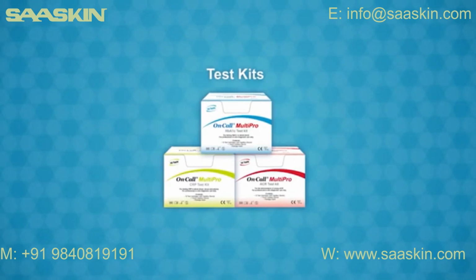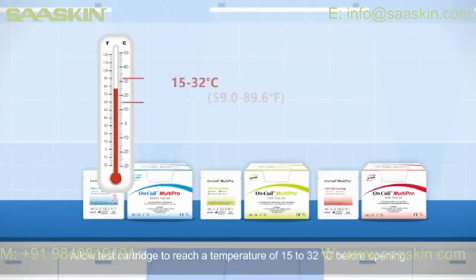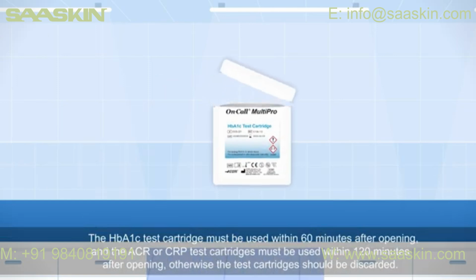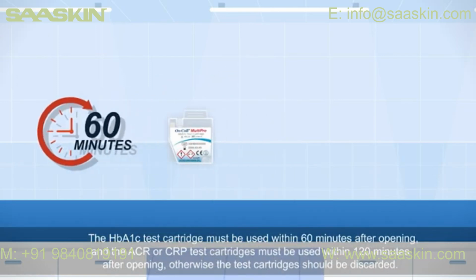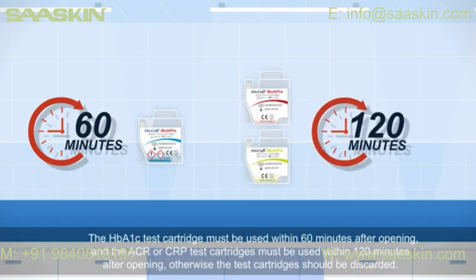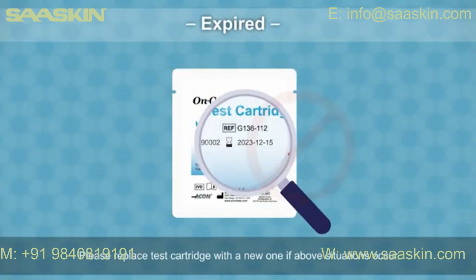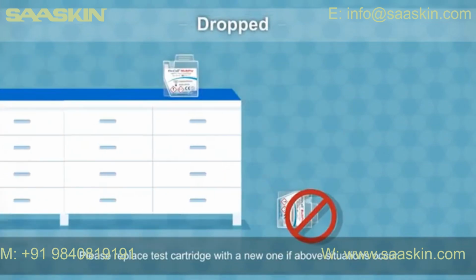Test kit. Allow test cartridge to reach a temperature of 15 to 32 degrees Celsius before opening. The HbA1c test cartridge must be used within 60 minutes after opening, and the ACR or CRP test cartridges must be used within 120 minutes after opening. Otherwise, the test cartridges should be discarded. Please replace test cartridge with a new one if above situations occur.